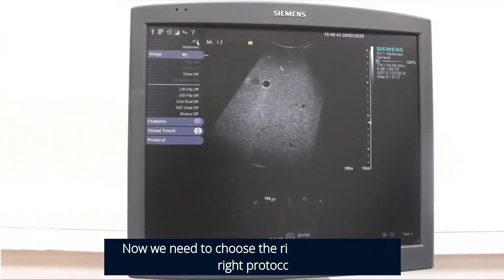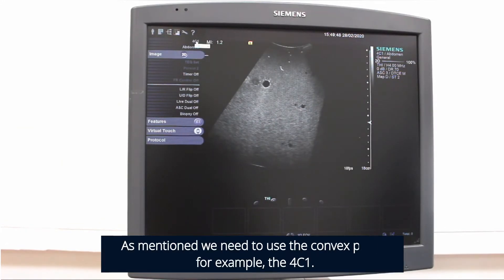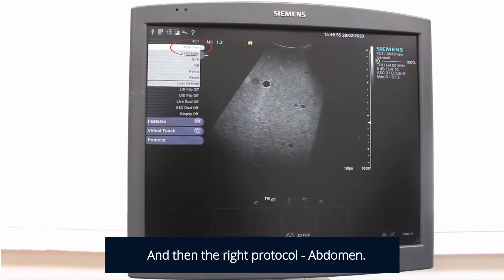Now we need to choose the right probe and the right protocol. As mentioned, we need to use the convex probe, for example the 4C1, and then the right protocol — Abdomen.